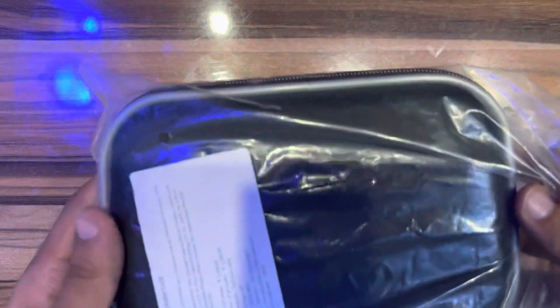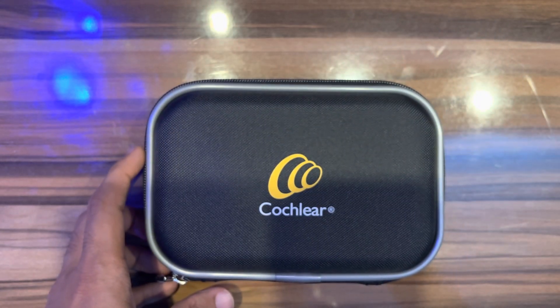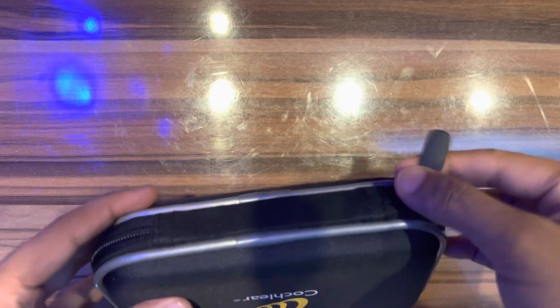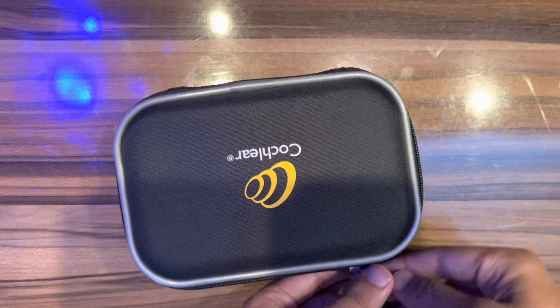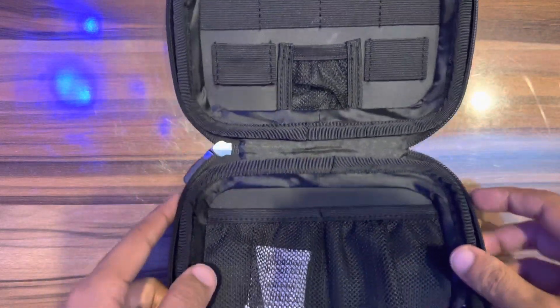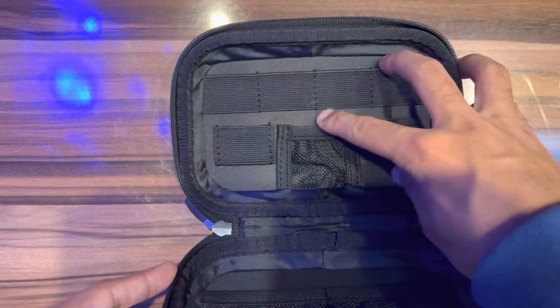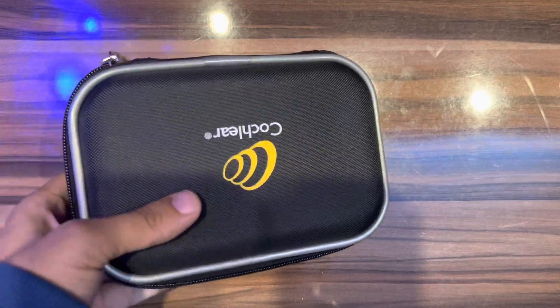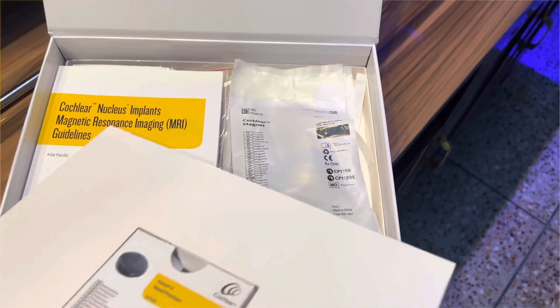The last unboxing item — I got it in black color. There is no different color, only black. The design is good and comfortable. Let me open this. It's very smooth. You can buy accessories if you want.